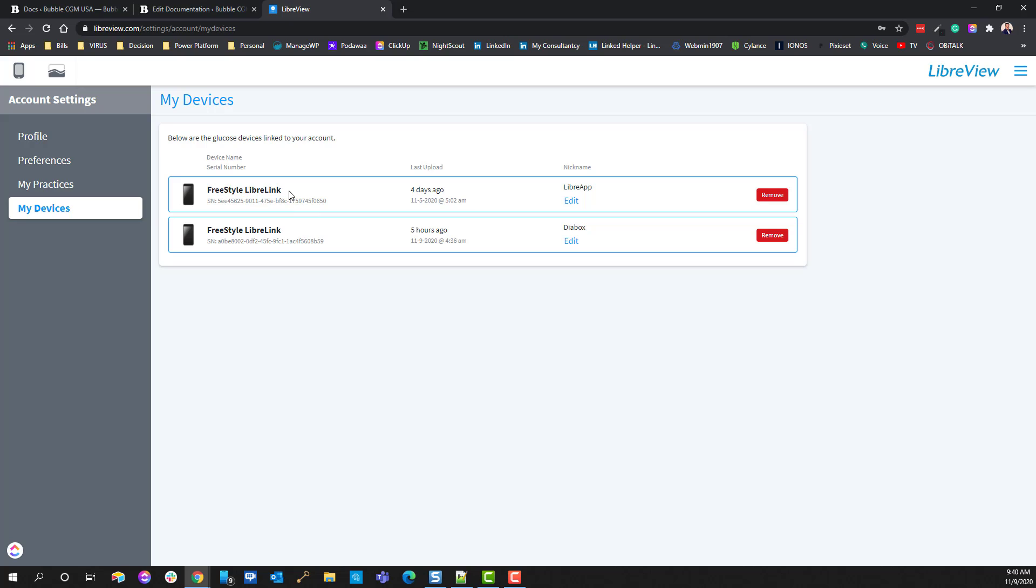Typically, the way that it'll work is the LibreApp will always be the first one, and then after you've added Diabox, it's likely always to be the second one. Another good way to help you determine which one's which is notice that this was updated four days ago when I had a sensor change.